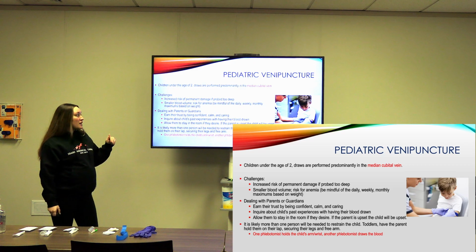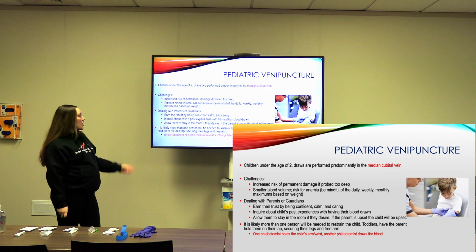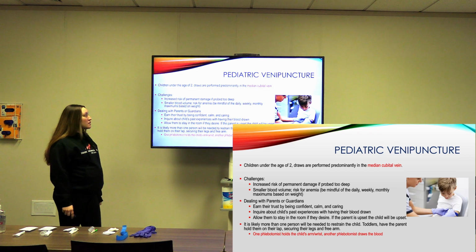Challenges for pediatric venipuncture in children of this age and this size are increased risk of permanent damage if probed too deep.